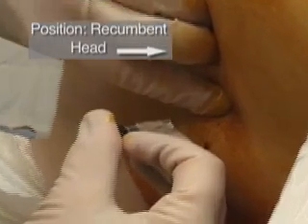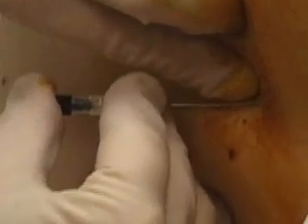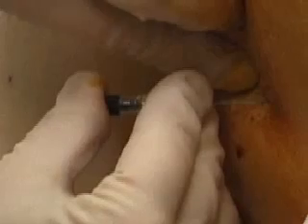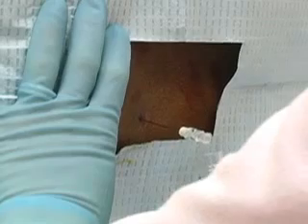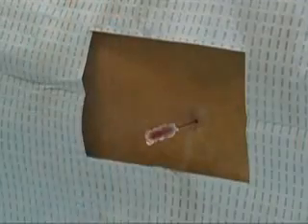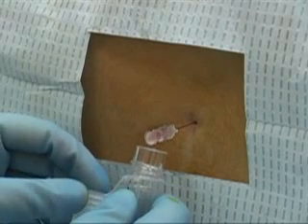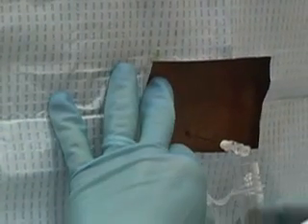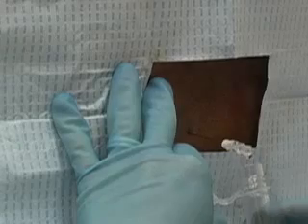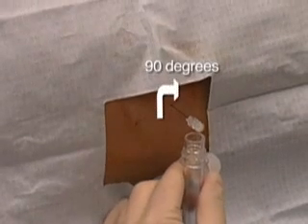If no fluid is detected and bone is encountered, withdraw the needle to the level of subcutaneous tissue without exiting the skin and redirect the needle. Fluid will flow once the needle enters the subarachnoid space. If the lumbar puncture is traumatic, the cerebrospinal fluid may be tinged with blood. As additional fluid accumulates in the barrel, the fluid should become clear, unless the source of the blood is a subarachnoid hemorrhage. If the flow is poor, a nerve root may be obstructing the opening of the needle, and you should rotate the needle 90 degrees.